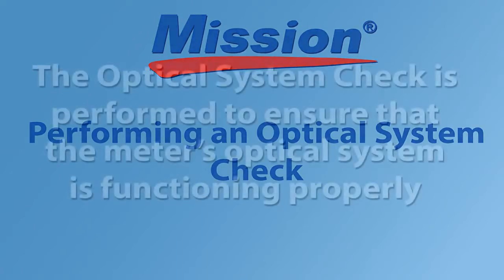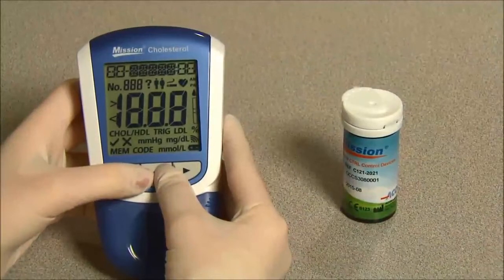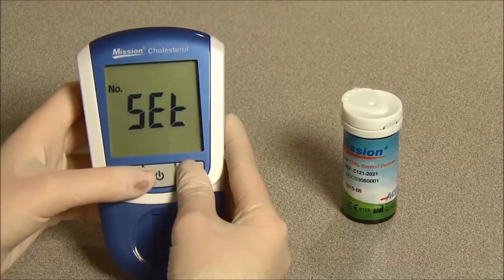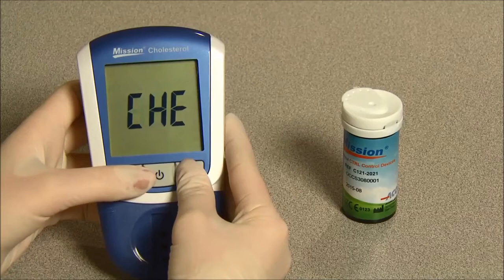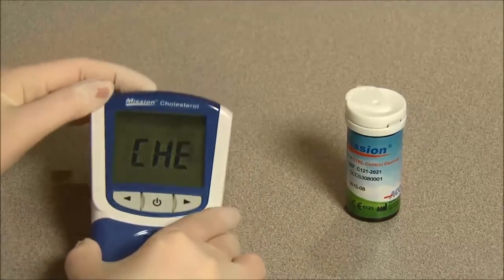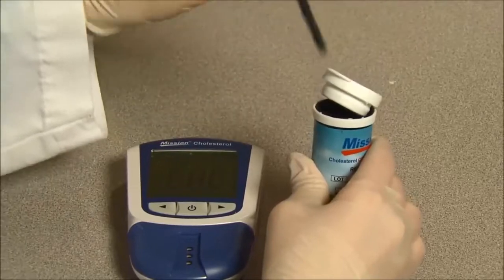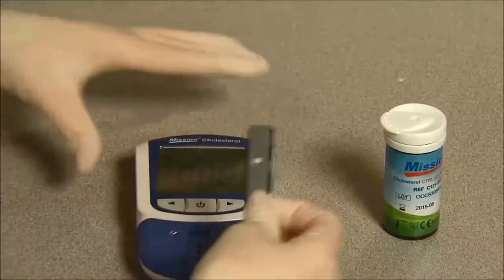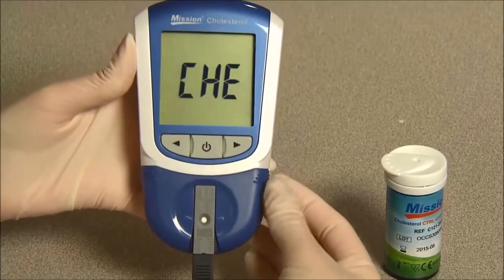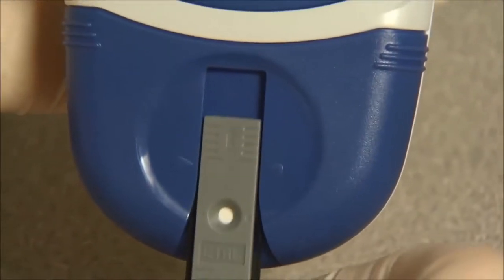Performing an optical system check. The optical system check is performed to ensure that the meter's optical system is functioning properly. To perform an optical system check, press and hold the power button for 4 seconds to enter the setup screen. Press right from the setup screen to select the optical check mode, CHE. Press the power button to enter this mode. The meter will flash the test device symbol. Open the canister and remove one test device. Firmly insert the control device into the device channel in the same direction as the arrows indicate, ensuring it is inserted all the way until the position arrows are parallel with the two arrows on the device holder.